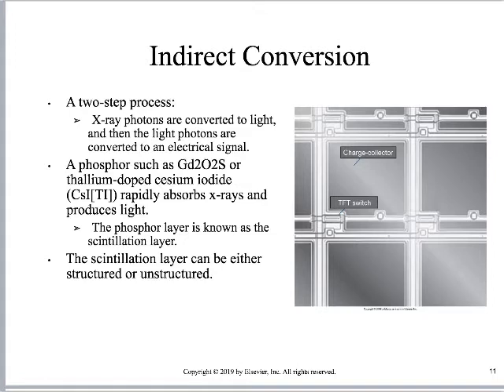So that light is unstructured because the crystal is unstructured. And so this results in light going out in all directions. That is a confusing signal. If you've got light going out in all directions, those light photons are bouncing off of things, it's making a muddled signal. That's what turbid means. When I think about the word turbid, I think about a mud puddle. It's kind of like a mud puddle, right? If you stir up the mud puddle, what happens? Mud everywhere, you can't see anything, right?